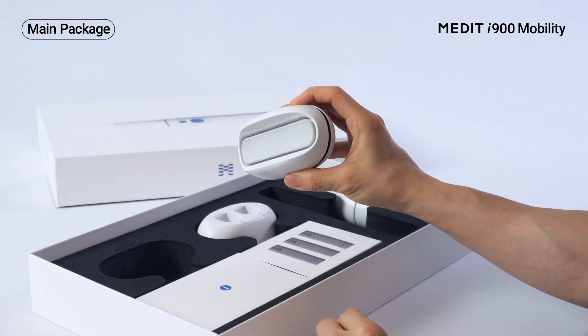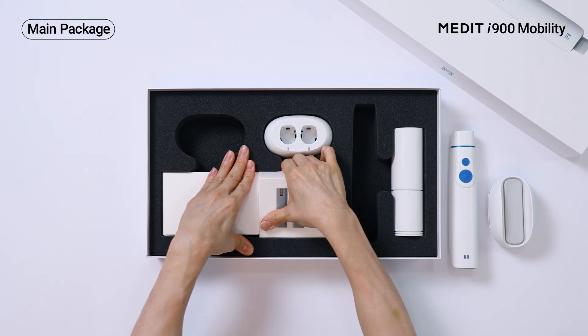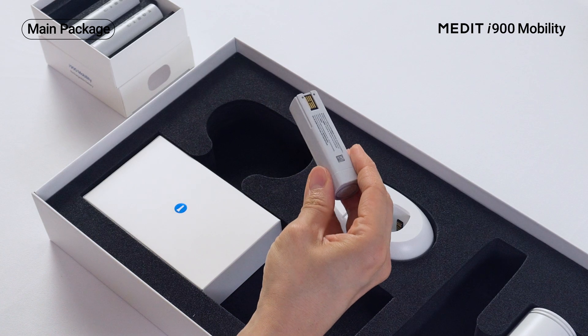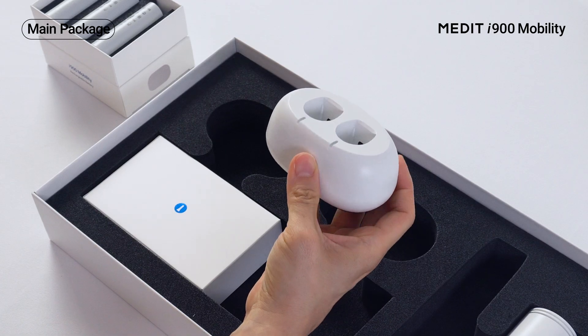It comes with a wireless hub that also works as a desktop cradle. Plus it includes three wireless batteries and a dedicated charger for extended use.